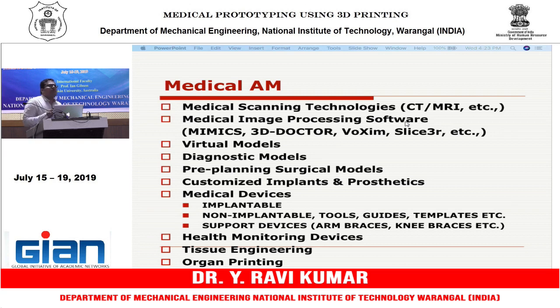So why do you want to process the DICOM image? Basically, a DICOM image is black and white. Professor Krishnanand was explaining the Hounsfield numbers, or the bone density. Based on the bone density, you have a gradation in terms of Hounsfield number. So you have a bone, and again you have a cortical bone or a spongy bone.